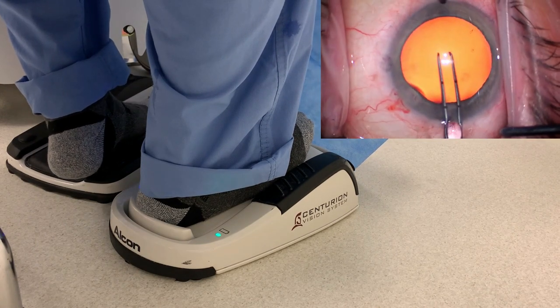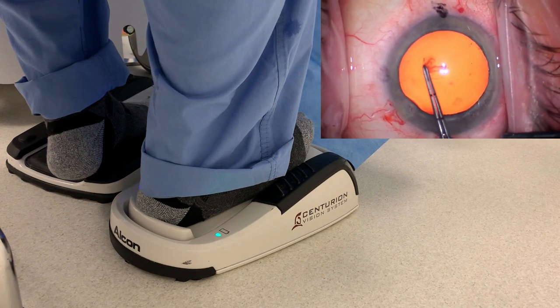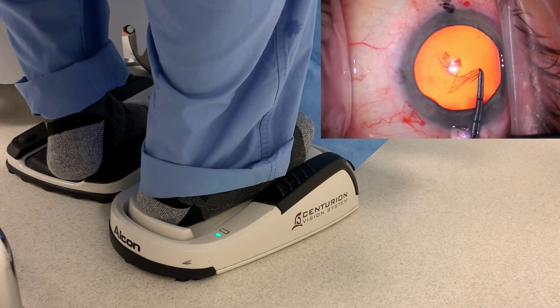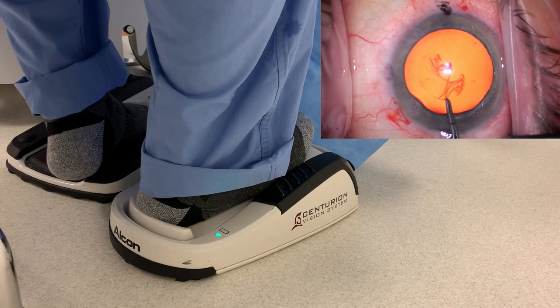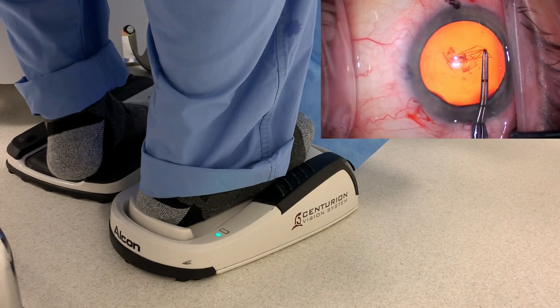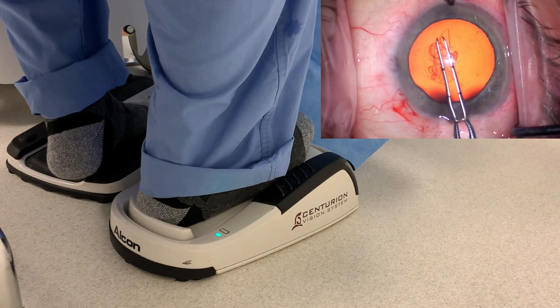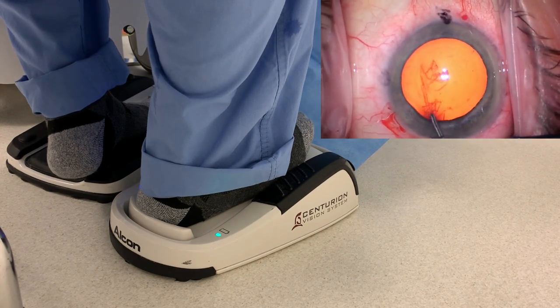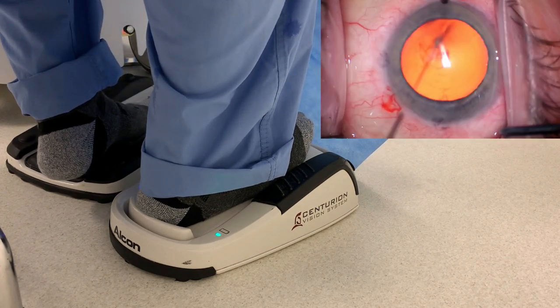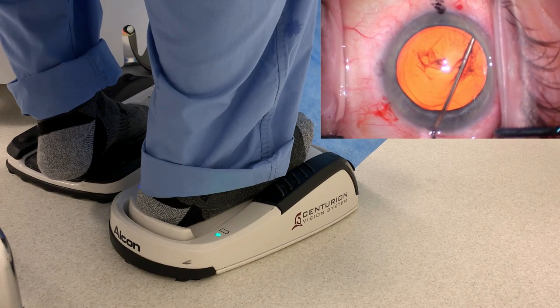Starting our rhexis — feet are relatively still during this part of the procedure. The feet are on the pedals, but we're not really stepping on any of them. Important that the pedals are not underneath you; they're actually a little bit in front of you. Like your pedals in the car — the brake and the accelerator are not under you, they're in front of you. Yes, they're below you, but they're in front of you.